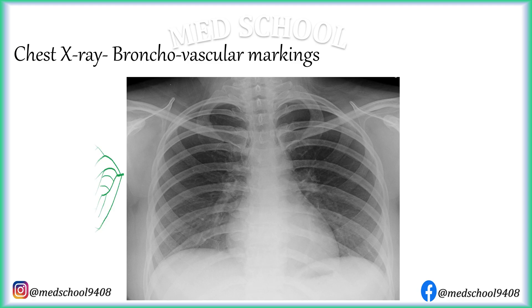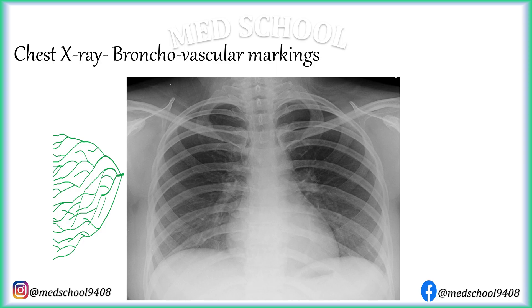Lung fields have reticular opacities in a tree-and-branches pattern. These are formed by small airways and pulmonary vessels, which is why they are called bronchovascular markings. Normally these markings are most prominent in the lower zone and they are not traceable till the lateral border of the lung field. Bronchovascular markings are considered prominent if they are more prominent in the upper and middle zone than in the lower zone, and if they are traceable till the lateral border of the lung fields.